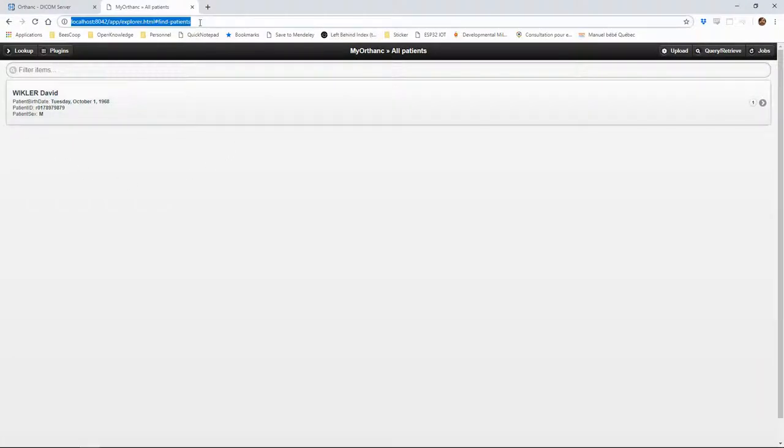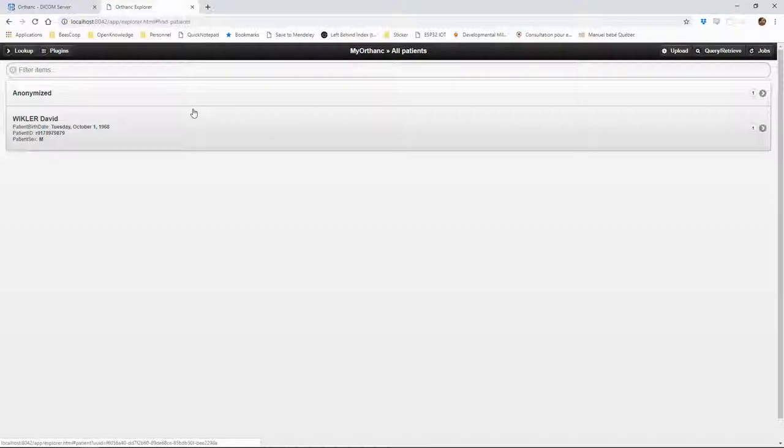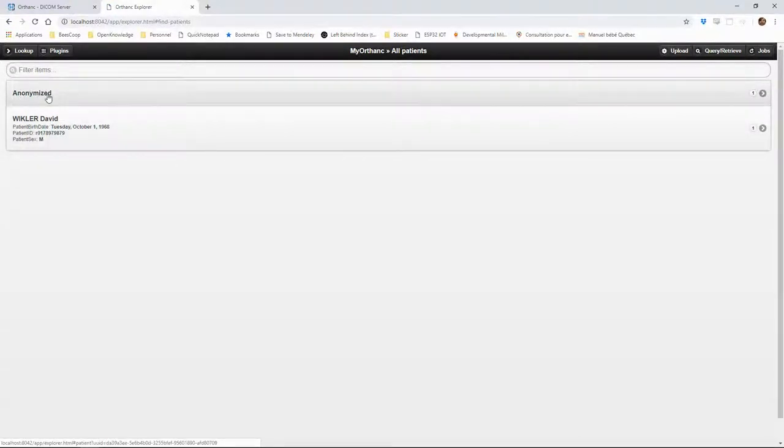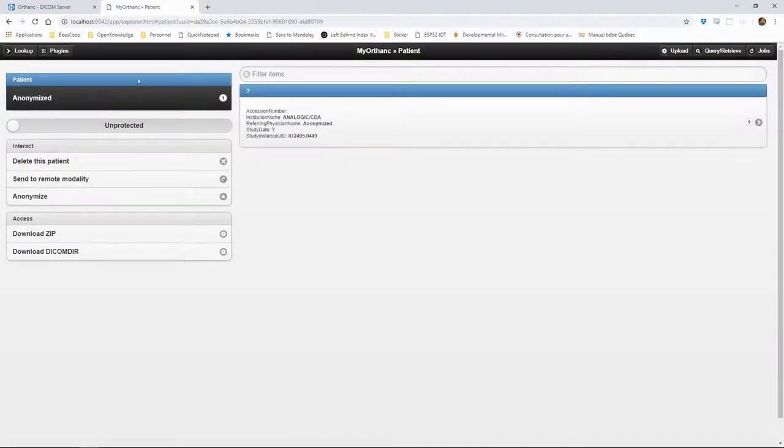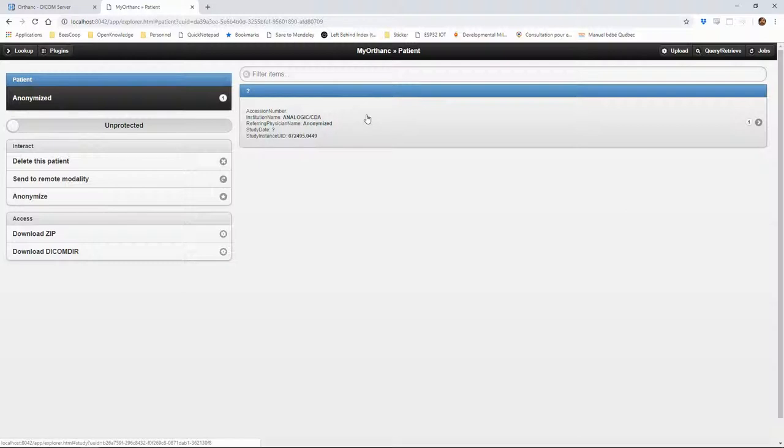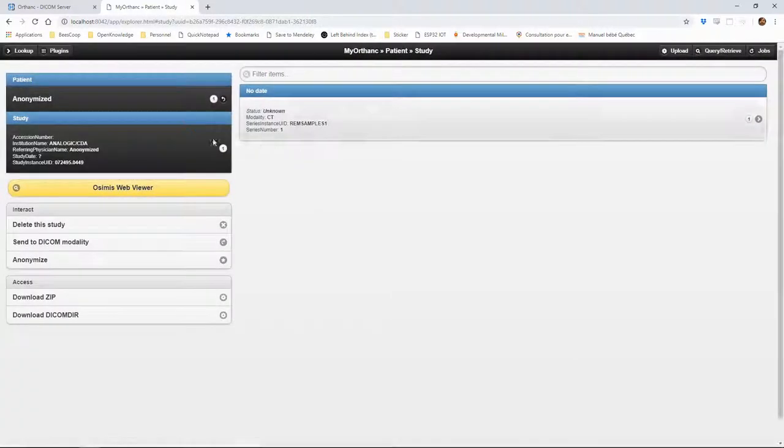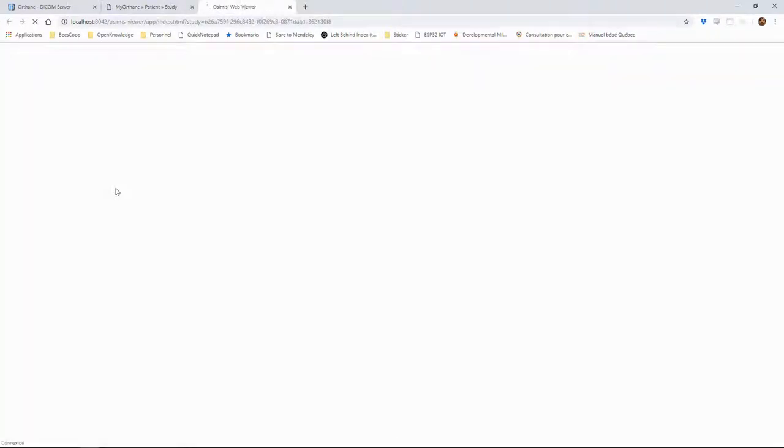If we refresh the Orthanc interface, we can now find the new patient in the list with the anonymized study that we sent. We can navigate to the study and use the Osimis web viewer to have a look at the image, which is now stored on the server.